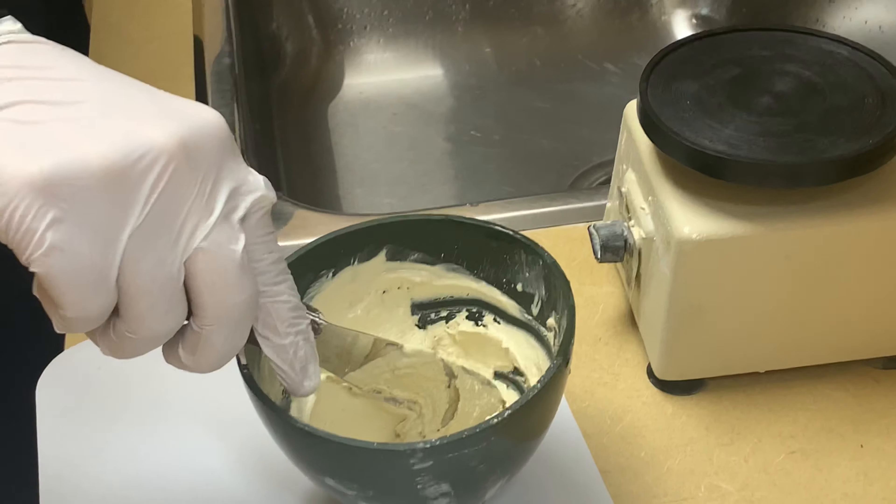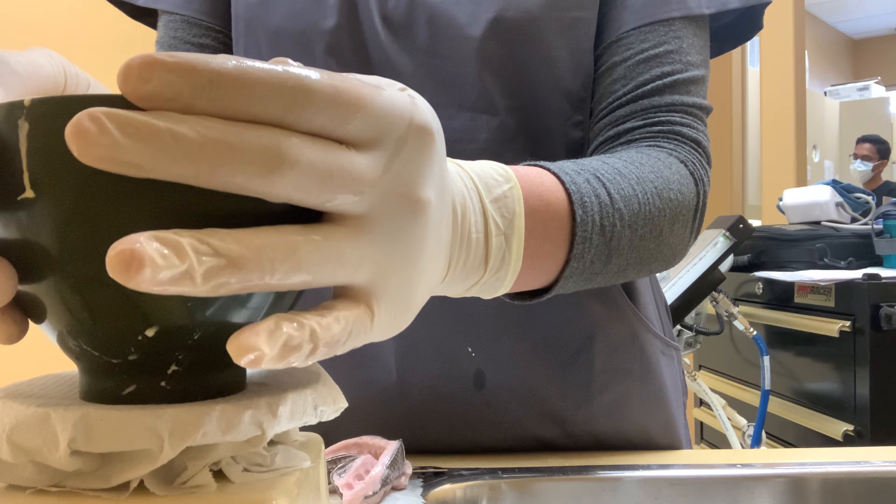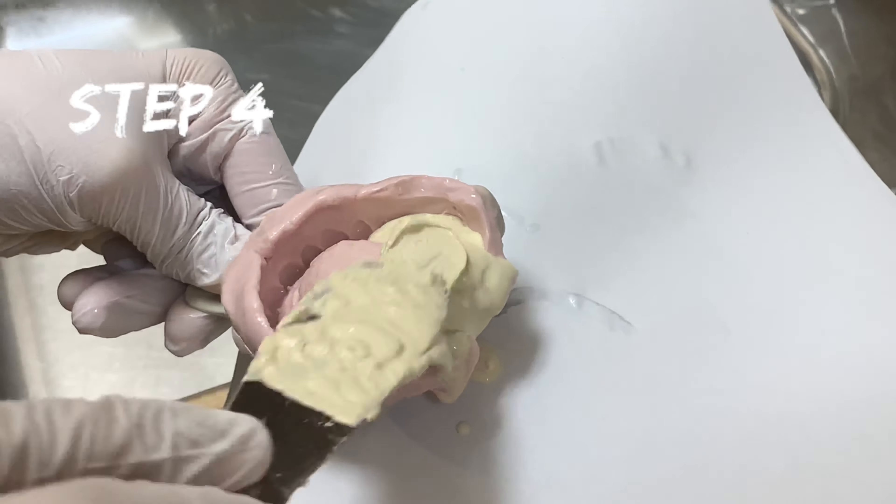The third step is to place the bowl on the dental vibrator for 15 seconds. This helps to decrease air bubbles in the mixture. Then place the impression against the side of the vibrator.